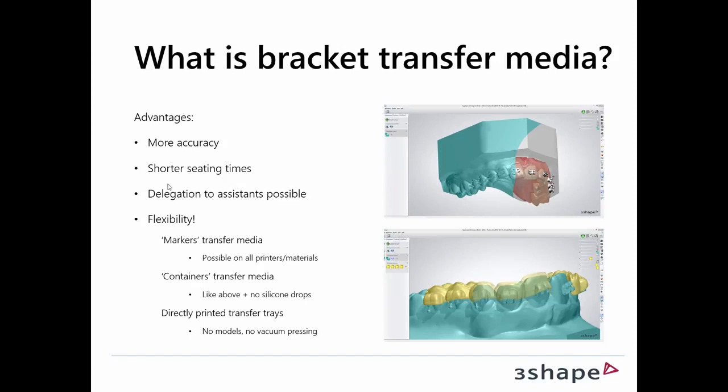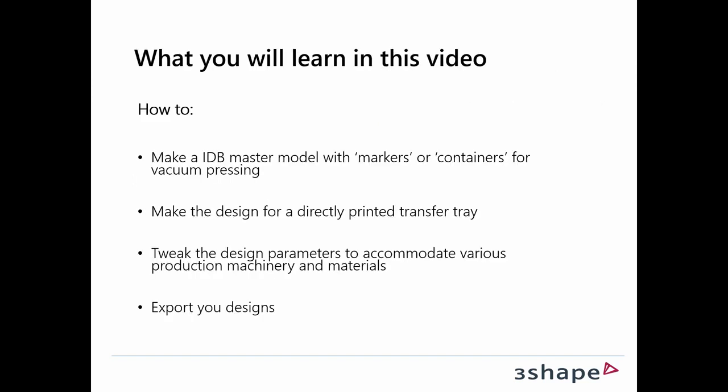There you have a very high flexibility when it comes to which printers can support it. We have another method where you can disable the need for silicon drops. And finally, we have a way where you can circumvent the entire printing of models and no vacuum pressing of these models being involved.